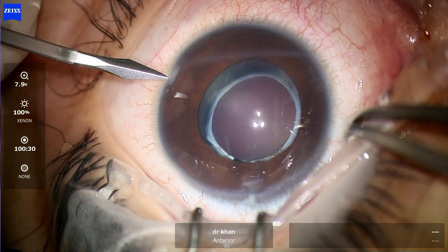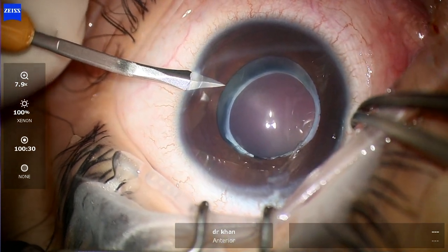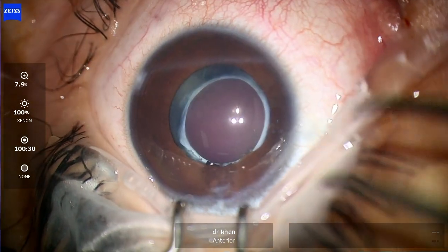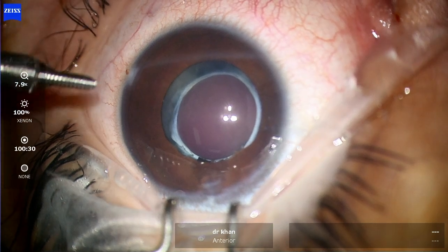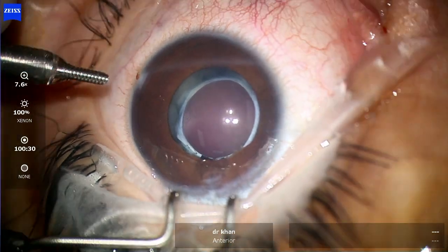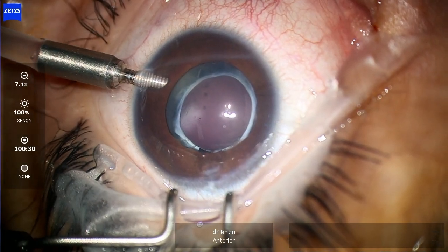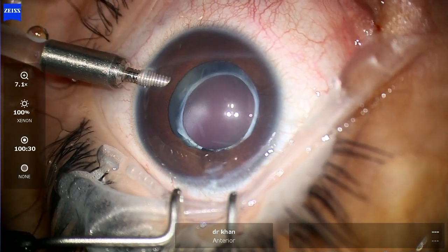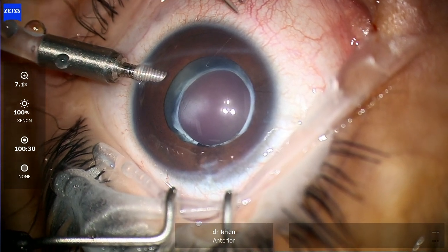This child was operated at almost 6 to 7 weeks of age, had a unilateral dense cataract, underwent lensectomy with a posterior capsulotomy, and this is him at almost three and a half years of age. So he was being managed with glasses and contact lenses, and the family decided to go for a secondary IOL implant.